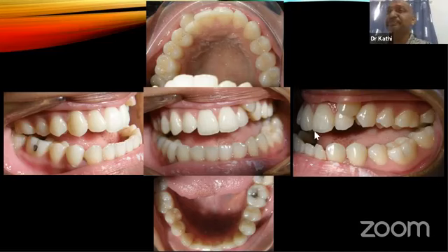So from the ODI, it shows he has a skeletal deep bite. So we talked about vertical discrepancy and sagittal discrepancy. This is transverse discrepancy. If it's a dental problem, when you upright the teeth they should meet each other. But if it's a skeletal problem, even when you upright the teeth they would not meet each other. Then that's how we know it's a skeletal discrepancy.